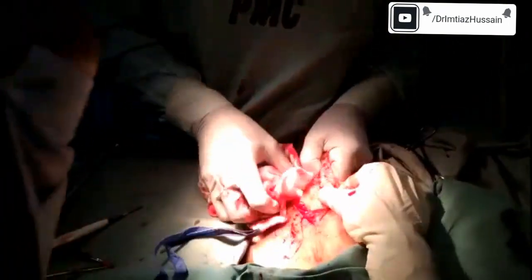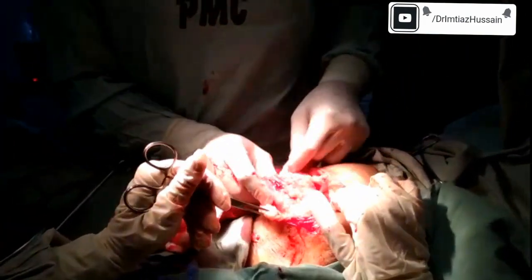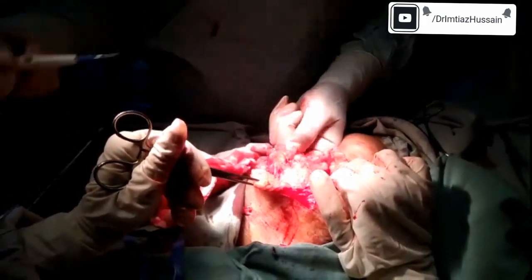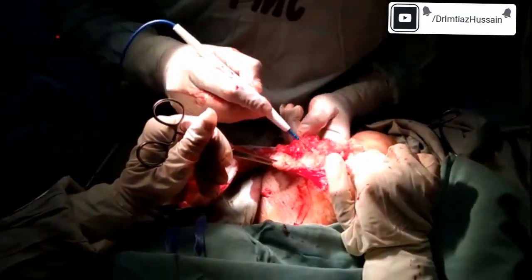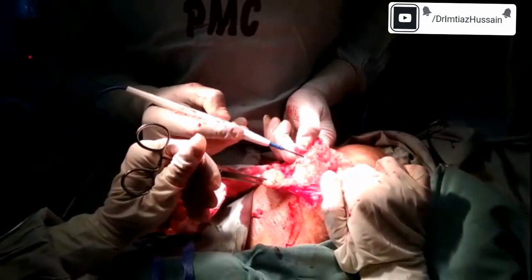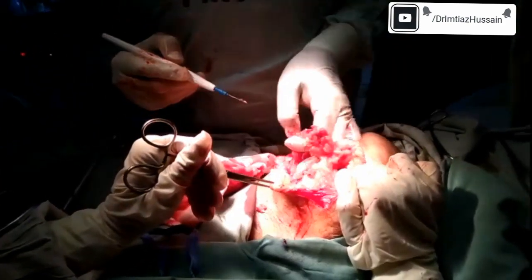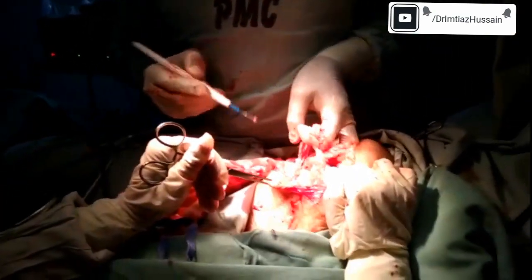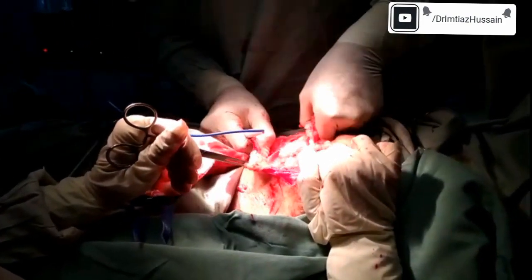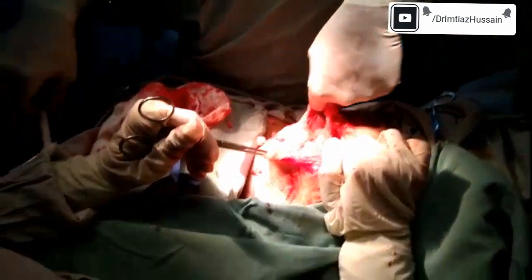We will have to do dissections all around this defect. With this dissection, we will reach up to the level of the neck. It is not always possible to achieve fine dissection because it is actually a scar area. This is an incisional hernia, which is not a named hernia like paraumbilical hernias, umbilical hernias, or inguinal hernias where there is a named defect.